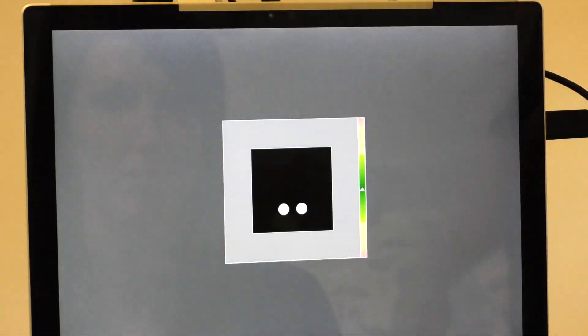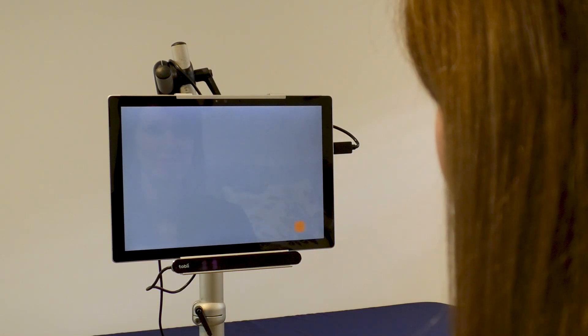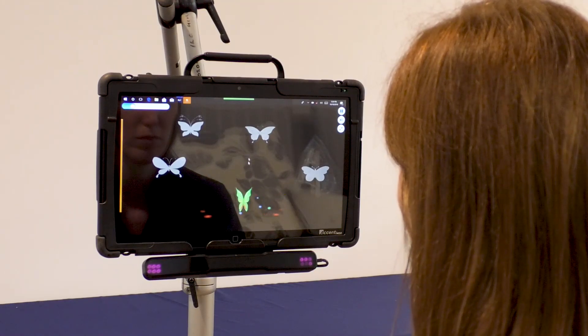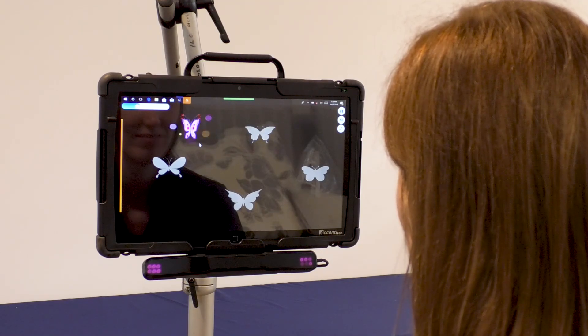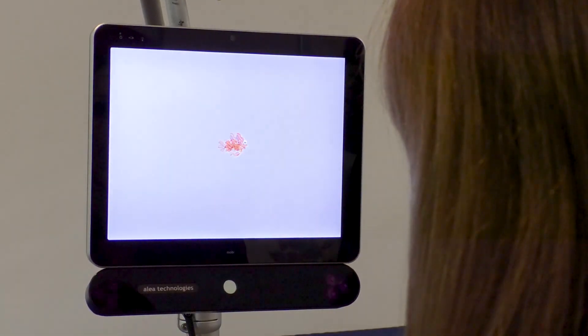Everyone's eyes are unique. For the system to work as accurately as possible, we need to teach it more about how the student's eyes reflect light when they look at different areas. This process is called calibration. For some students, attending to targets on the screen can be tricky to begin with. It's not necessary to complete a successful calibration to start the very early stages of eye gaze — a default calibration may be used. Early eye gaze activities will support students to develop the skills they need to achieve a calibration down the track.